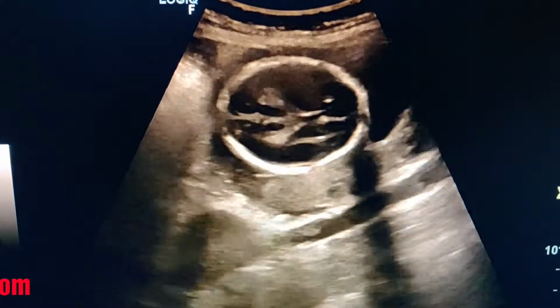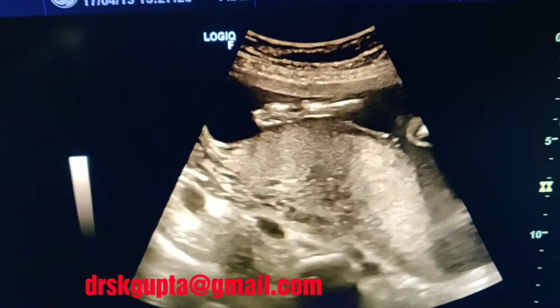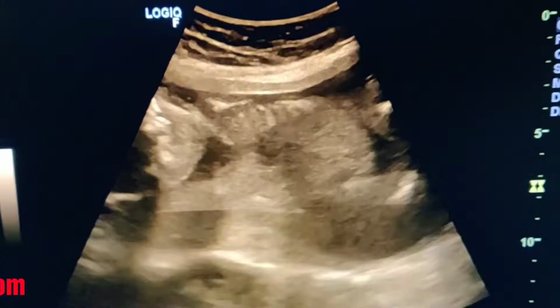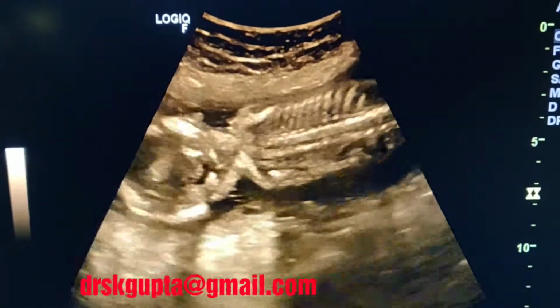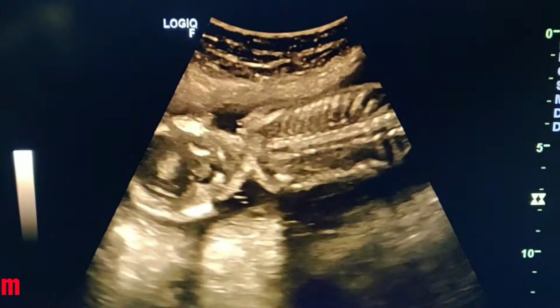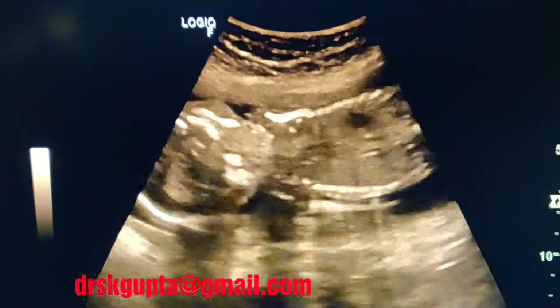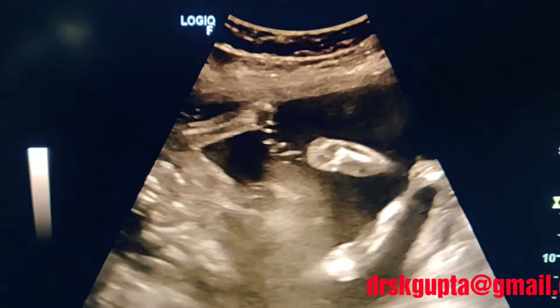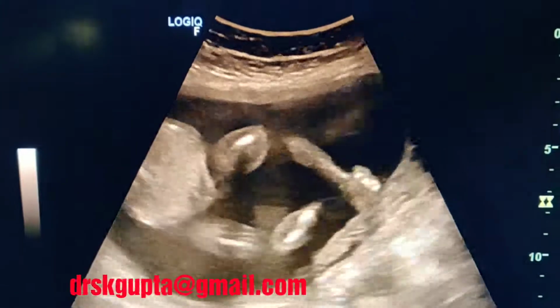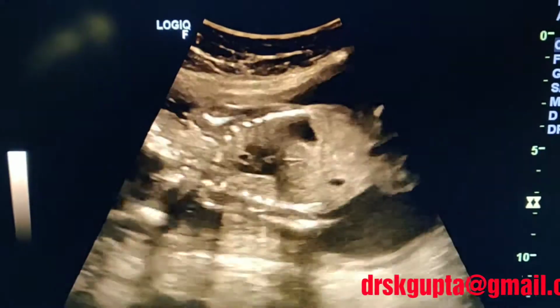in the axial scan. This is the hand of the baby. This is another hand of the baby. This is the spine in the coronal section. I love this section because it shows the stomach, it shows the heart, and it shows the bladder also. We'll see this coronal section of the abdomen in times to come. See, this is the section which I was talking about.